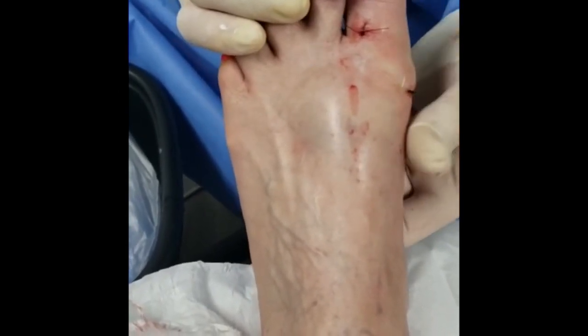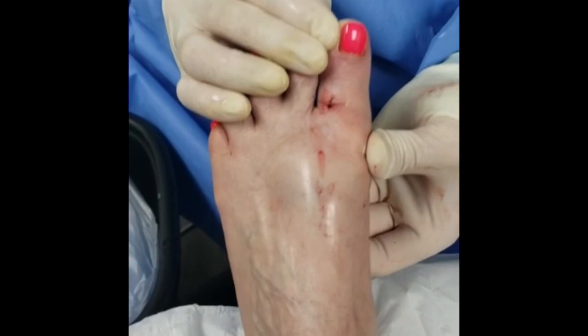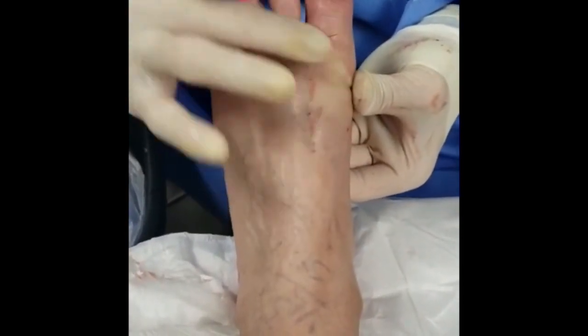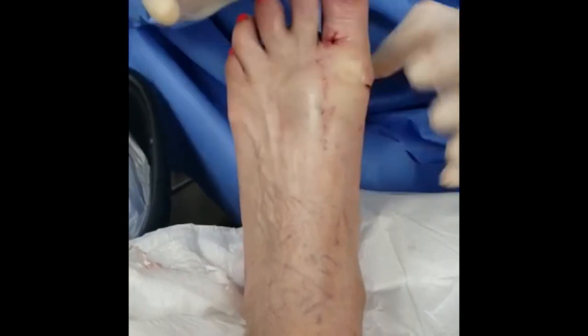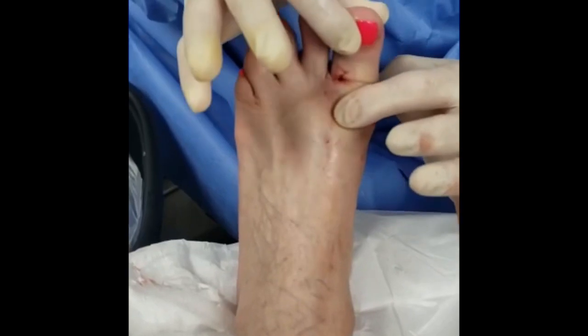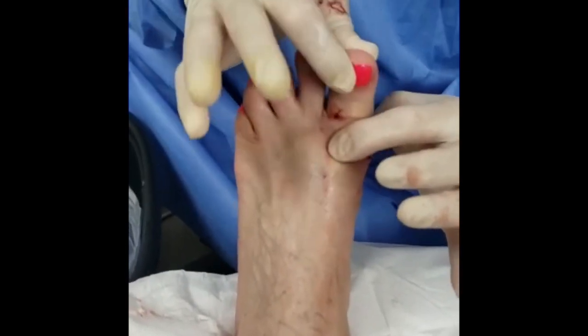As everyone can see, we were able to shave it — it's going to look really nice. The purpose of the procedure: on the top we no longer feel that bony prominence that was limiting her range of motion. Even now she has more range of motion than before. So in closing, the procedure was a success and the outcome was also a success.